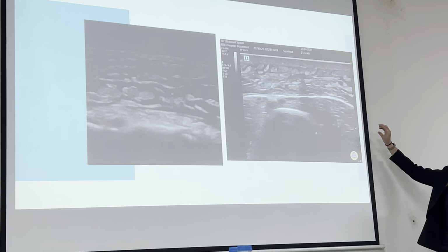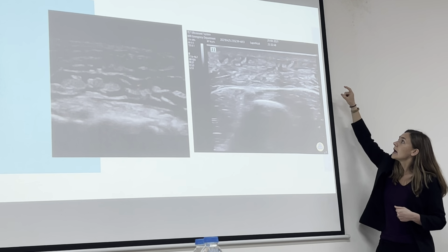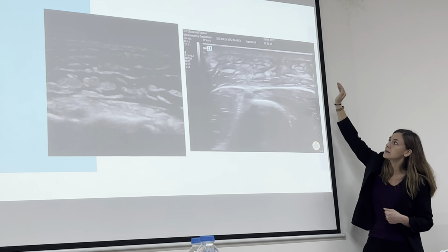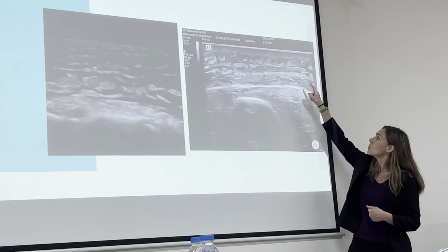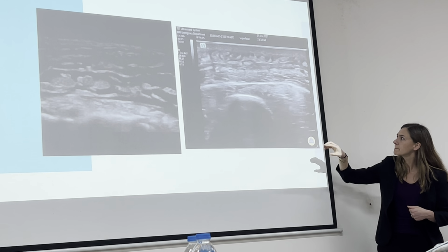What you're going to notice first in something like cellulitis is a thickening of the dermal epidermal layer as well, and then you're getting thickening afterwards of the subcutaneous tissue layer. And then depending on the degree of the edema nearby, you will see more of those fat lobules individualized, so you'll see more stones in that cobblestoning appearance.